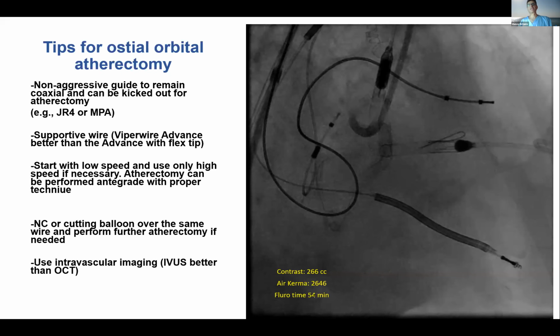So sometimes just taking a deep breath and letting it go might be the way to go versus getting really, really super aggressive and potentially having heavy complications, because as you heard before from Lindsey, perforation is always a possibility, especially for highly tortuous vessels. So many tips, but sometimes being less aggressive might actually be the way to go.